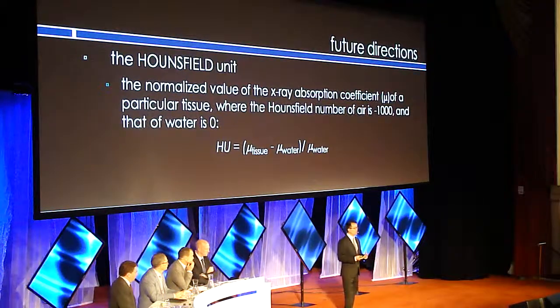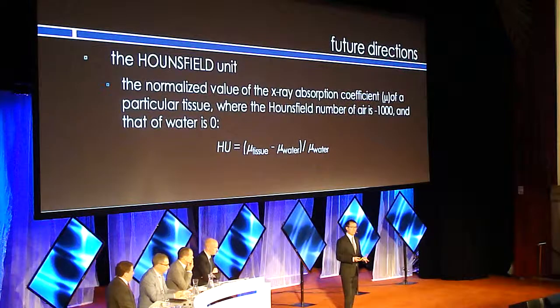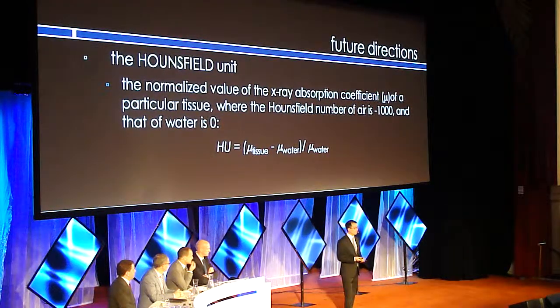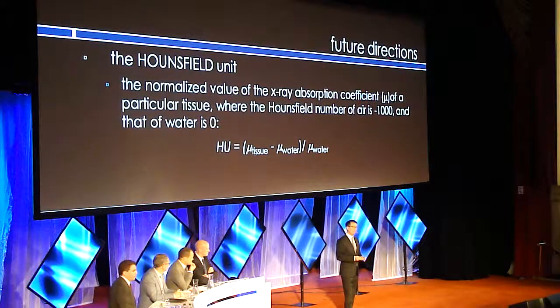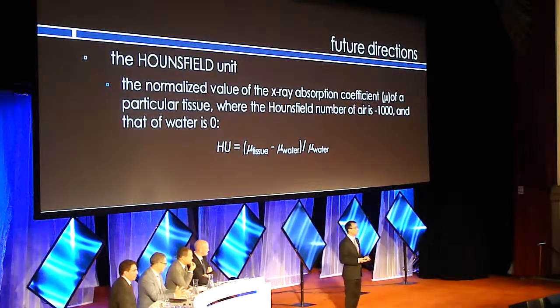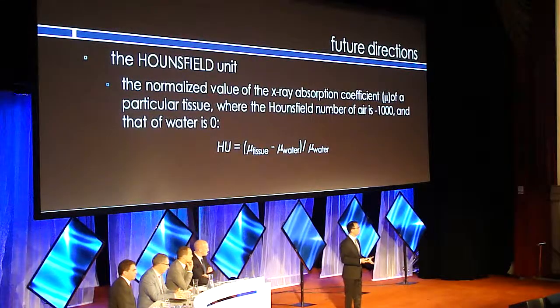One of the things that people have tried to do for a long time now is trying to quantify bone density from cone beam CT scans. And unfortunately, in spite of the fact that a lot of people are doing this, the numbers are actually very unreliable.